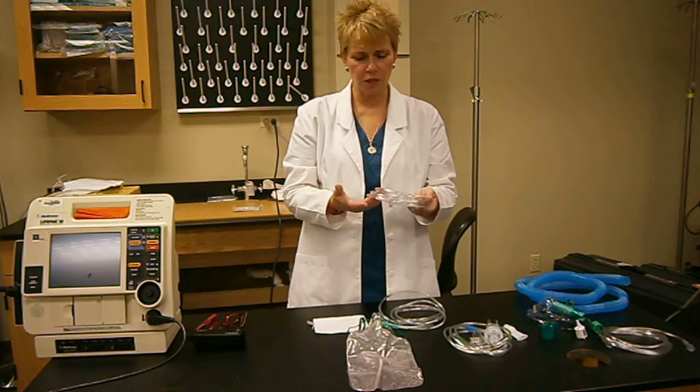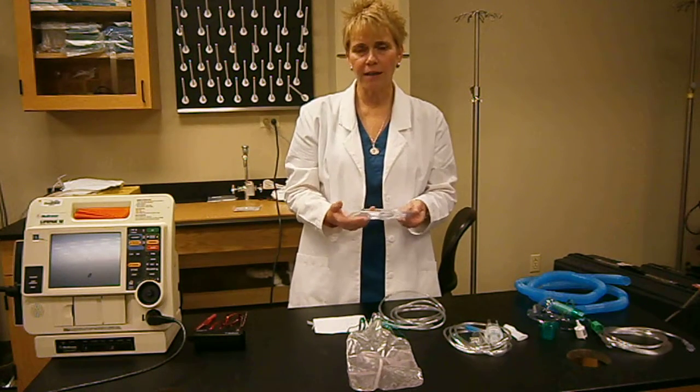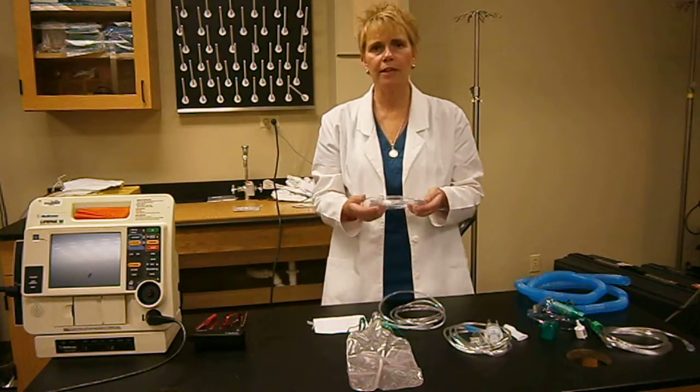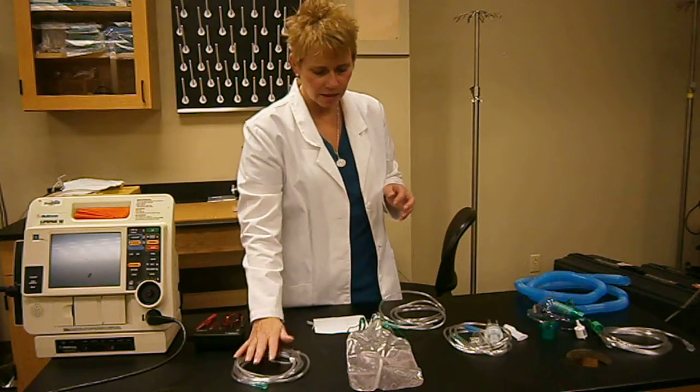However, if you have a patient that's been on long-term oxygen and remains in the hospital, you may want to humidify it at a lower level of 2 or 4. It just really makes them more comfortable and they don't have any skin breakdown inside the nose.